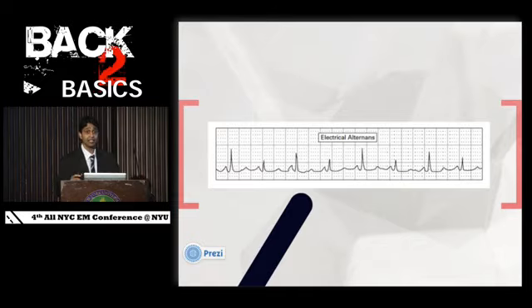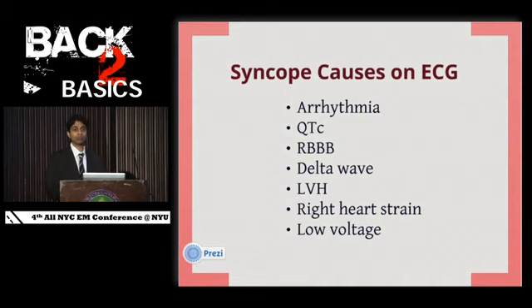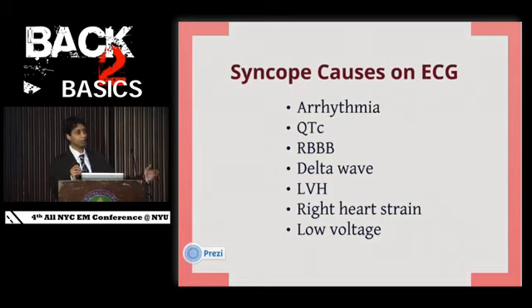All right, again, this is the list of things, and the message is when you get EKGs, save your brain power. So when a nurse tells you that a patient needs 5 and 2 of Haldol because they're spitting and swinging, you don't have to think too much. Give them the medicine. With an EKG, you really want to stop, make the whole world freeze for a second, and look at that EKG, put it in context, and look for your specific diagnoses that you're thinking about. And that's all I have for you.